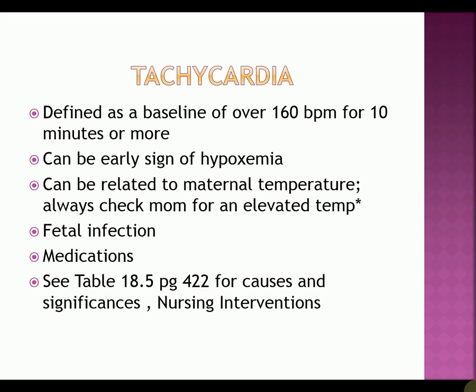It's an early sign of hypoxia sometimes when you're seeing a baby running tachy. They're not getting enough oxygen and their heart rate increases just like it would with anything else. It can be related to maternal temperature, so always check your mom's temperature whenever you start seeing tachycardia. It's also a high indication of fetal infection, especially if mom is running a temperature, but the fetus can actually have infection that mom's not. It can also be related to medications.